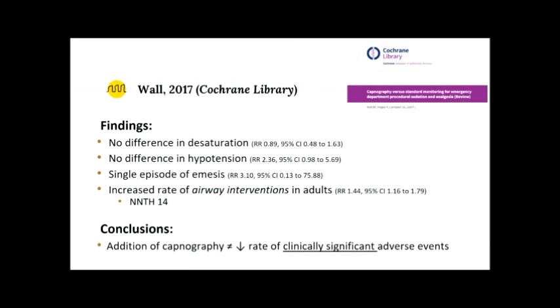So from this, their conclusion was that the addition of capnography does not reduce the rates of clinically significant adverse events, which is the message that I think we should be taking from here. There's no change in our clinically significant adverse events.